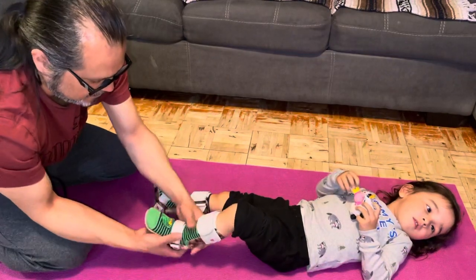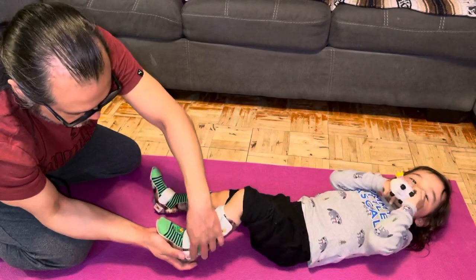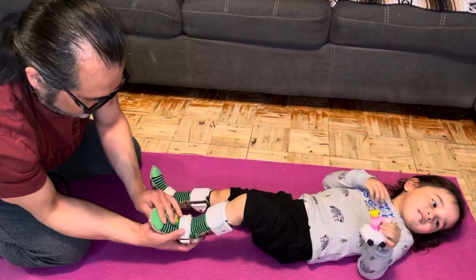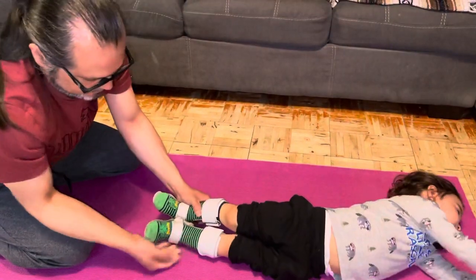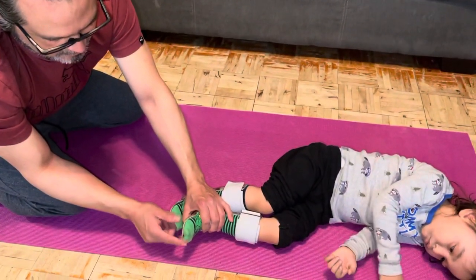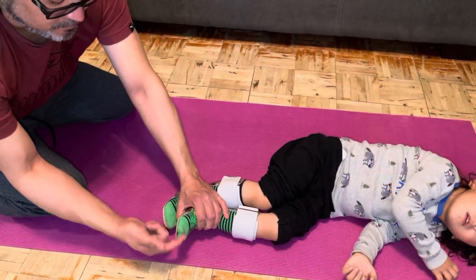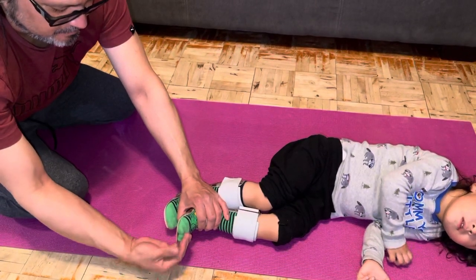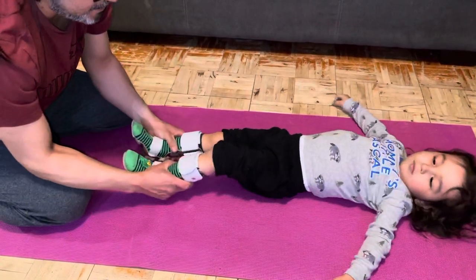Then you just put that on again. You want to make sure that his heel is towards the back. If you have a look, you'll see how far his feet are — right now they're almost even. As his foot grows it'll start to get longer, so you use that to measure whether his foot is back far enough on the heel.